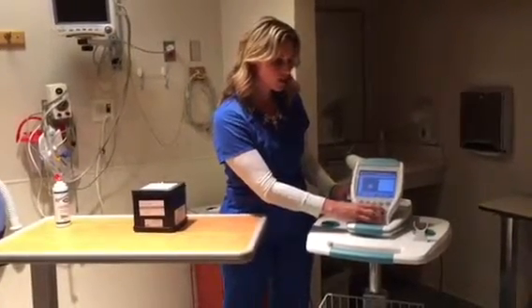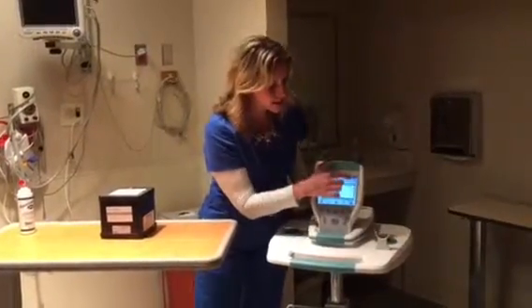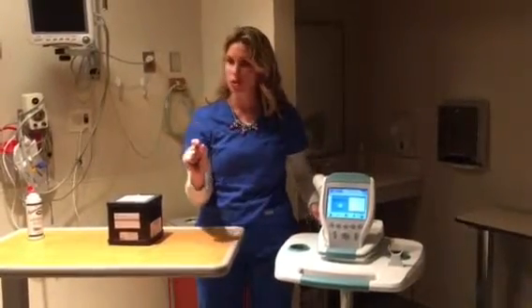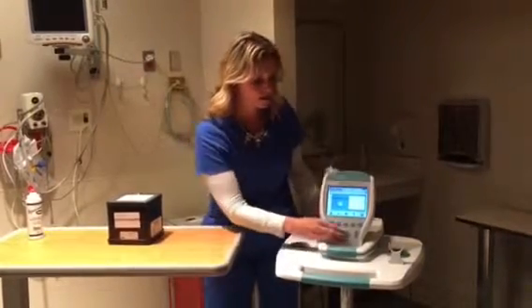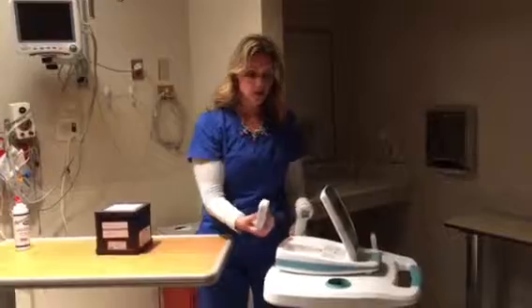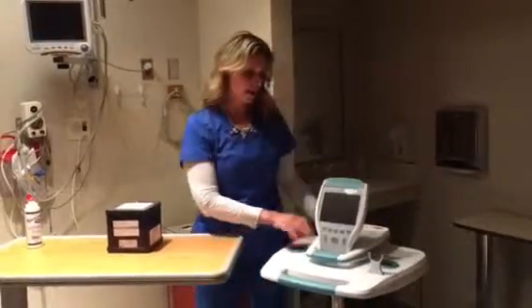Spa music to get your patient relaxed and in the supine position. In the front here, you are going to see a battery life indicator. And right now it's full, so it's completely blue. But if you turn on the machine and it has just a quarter or just a little sliver of blue in there, that means that the life is almost over, and just turn off the machine and pull out the battery. Your extra battery is going to be in your storage room, and it lasts about 2 weeks. Each battery does, so you never have to plug it in. Just simply go find the new battery if you need it.